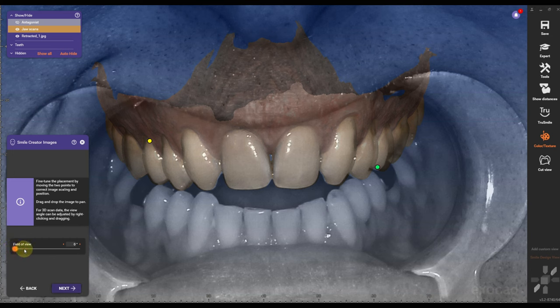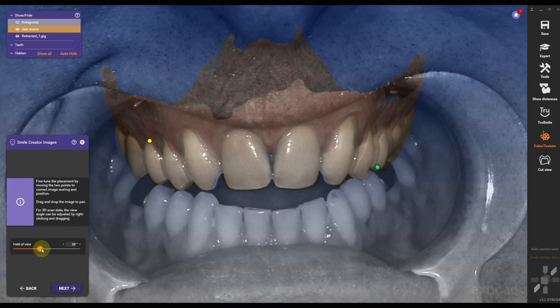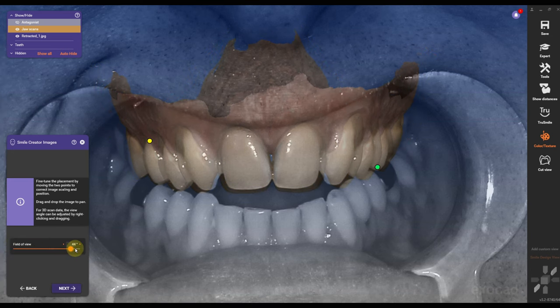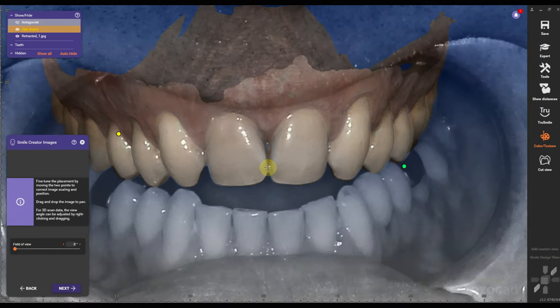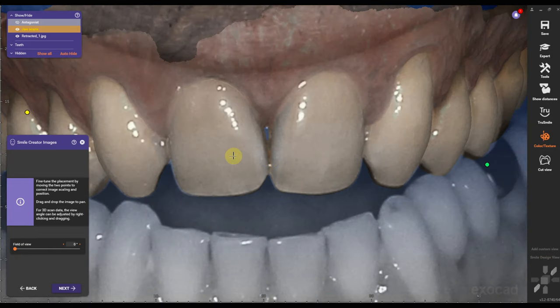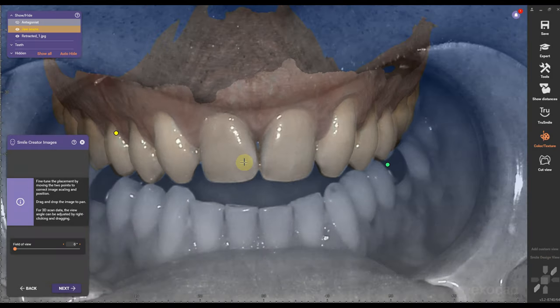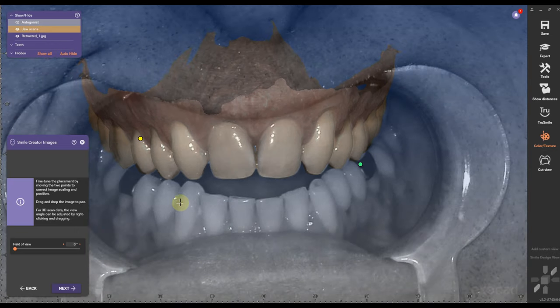I can also morph the scan if I take photos with a cell phone. The most important part is that the centrals and the laterals — I don't have any laterals in this case — are perfectly aligned, especially the midline.